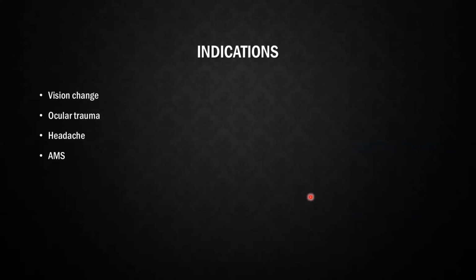So some indications include vision changes or eye pain, ocular trauma, headache, altered mental status, anything where you have a concern for elevated ICP. Now, despite popular belief, there's actually no absolute contraindications to doing this exam. There are some relative contraindications. Globe rupture, lid lacerations, or significant facial trauma could potentially complicate this exam, but there's no actual absolute contraindication.